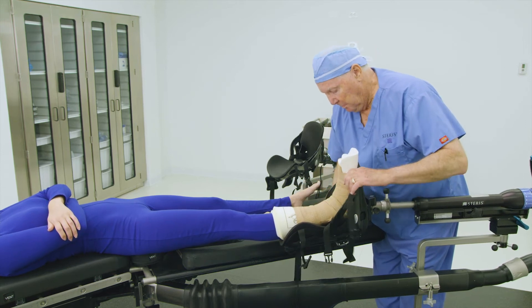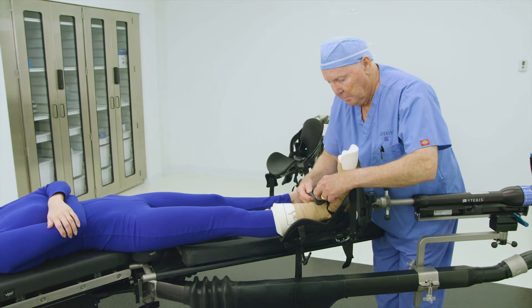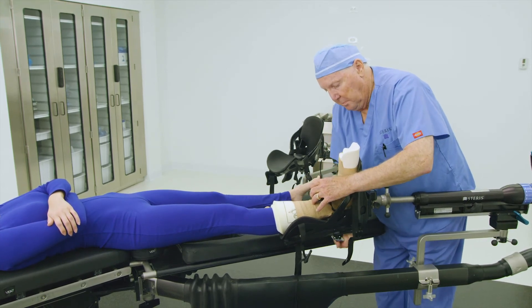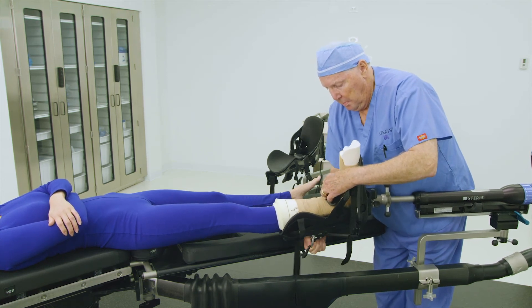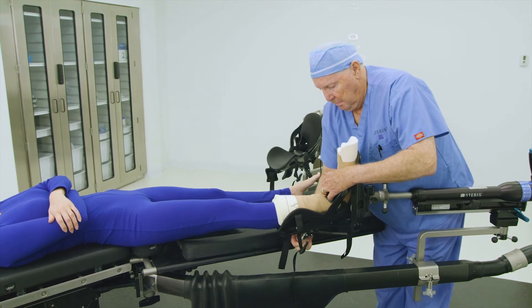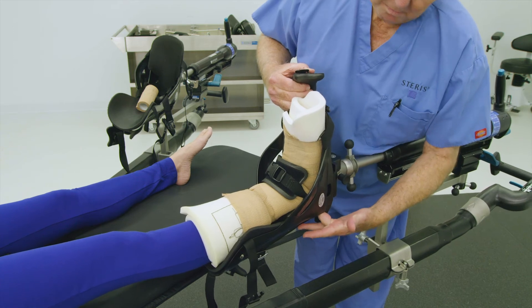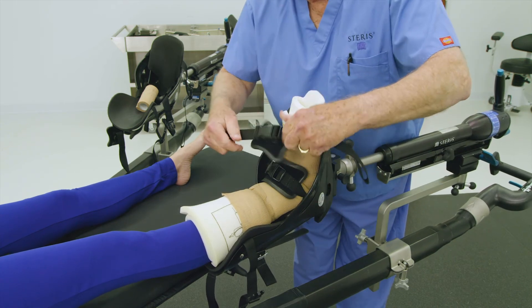Ensure the Achilles pad is positioned against the Achilles tendon. Next, buckle the middle strap and ensure the strap is directly over the top of the ankle. On the underside of the boot, tighten the middle strap using the strap ratchet assembly until the ankle is secure. Finally, buckle the toe and calf straps and tighten straps securely. Ensure all buckles are centered.